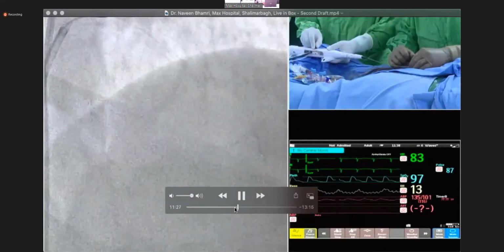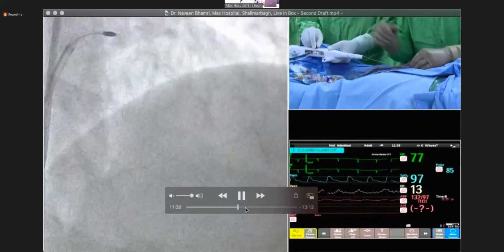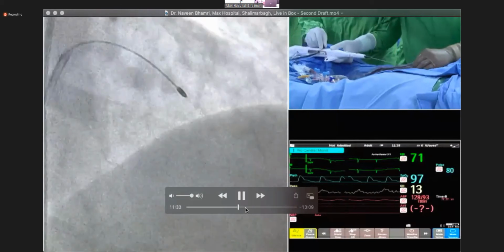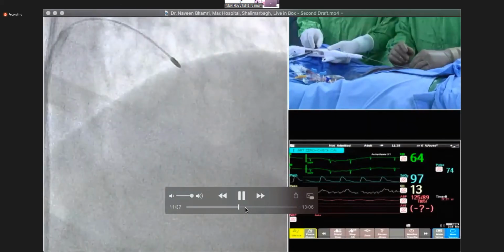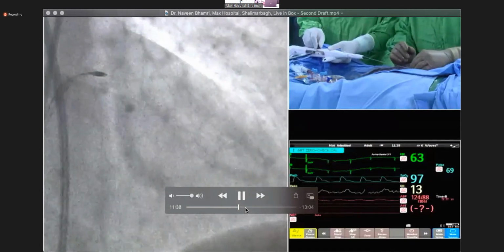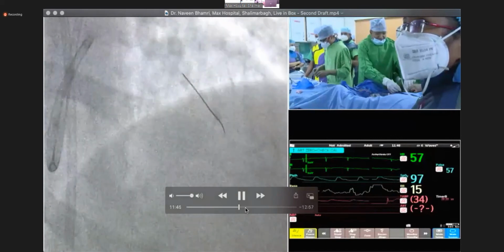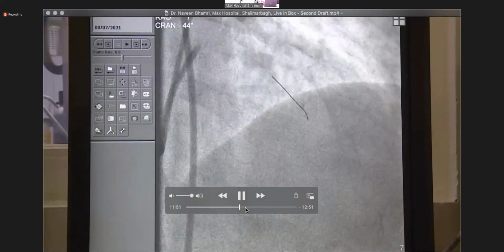This is the dangerous point actually. Stopping. So we are done with the rota. Pressure is fine. Now we will pass the microcatheter again to exchange the wire.